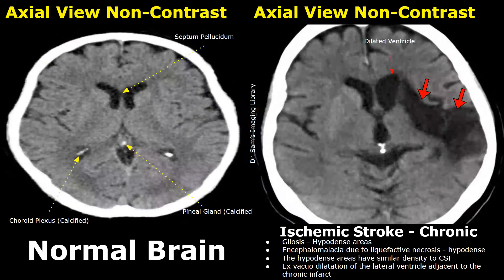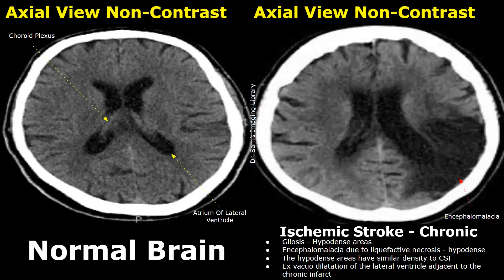Here is another case of chronic ischemic stroke. We can see a dilated lateral ventricle due to ex-vacuo dilatation of the lateral ventricle right next to the chronic infarct. There won't be any swelling at this stage. There are areas of encephalomalacia and gliosis. Usually the area of encephalomalacia is much darker than the area of gliosis. This is another case of chronic ischemic stroke — no swelling, mass effect, or midline shift is seen. There is ex-vacuo dilatation of the lateral ventricle right next to the chronic infarct, and also encephalomalacia and gliosis.